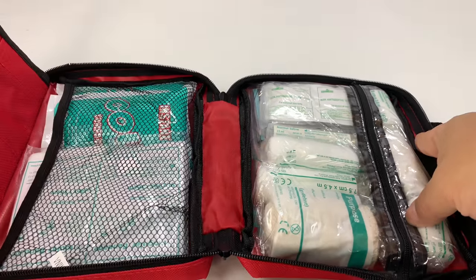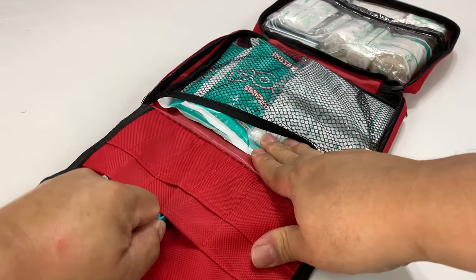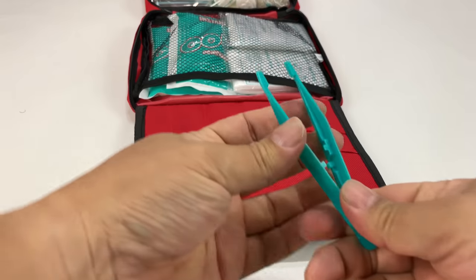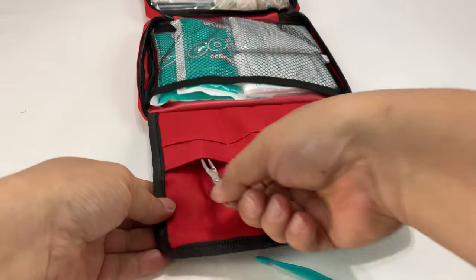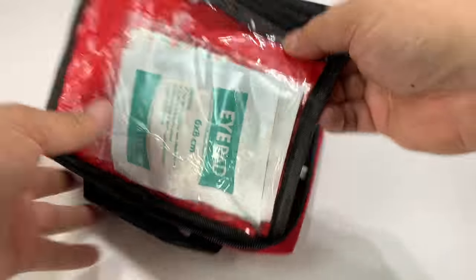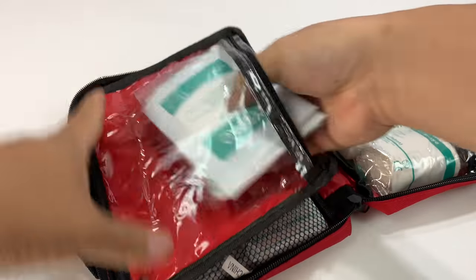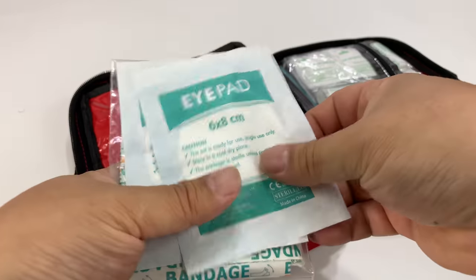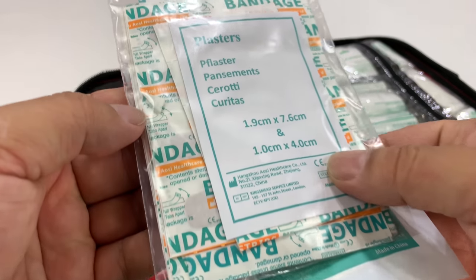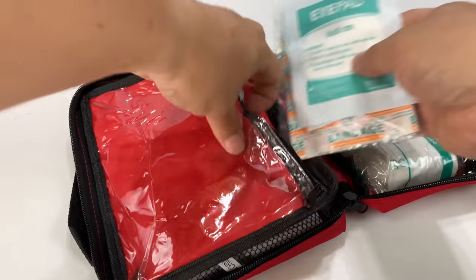This is a pretty complete kit. We have some plastic tweezers, and also some scissors on this flap which opens up this way. In this clear pouch we have six by eight centimeter eye pads — at least two of them. And then we have plasters, which are essentially bandages. Looks like we get a whole assortment of those.